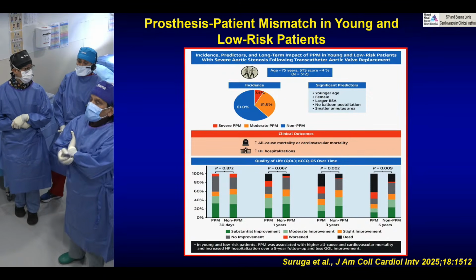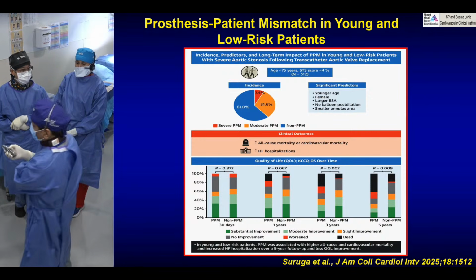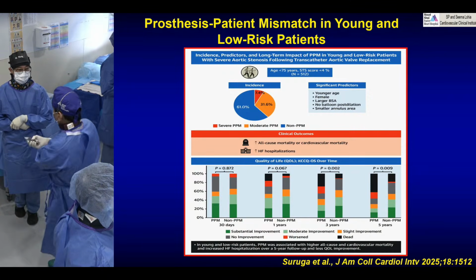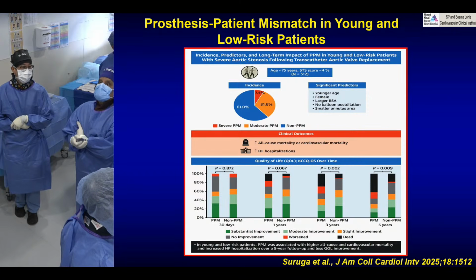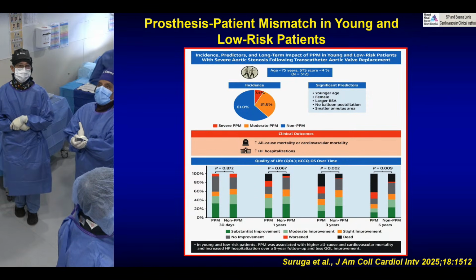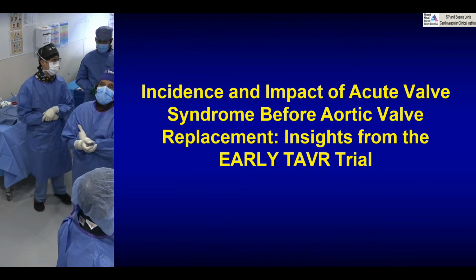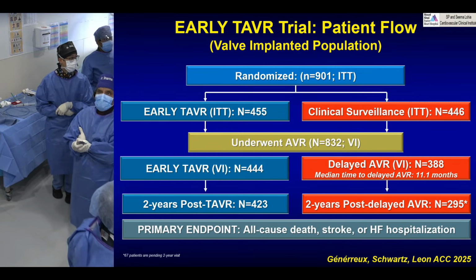Good. Now, we don't do it, but do we ever do a balloon expandable valve with the additional balloon material, meaning using the true balloon? We don't use the true balloon because of the additional cost associated with that. But some people have done it for mitral, to be able to get a better expansion because they worry about valve migration.